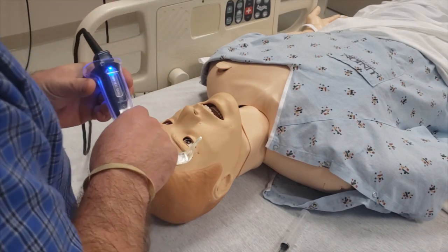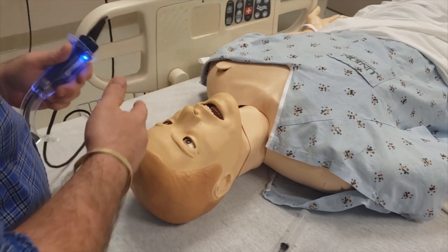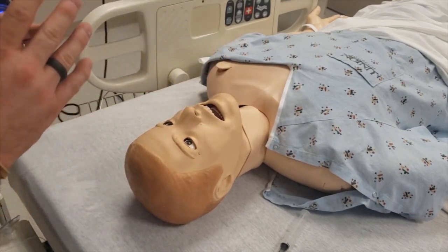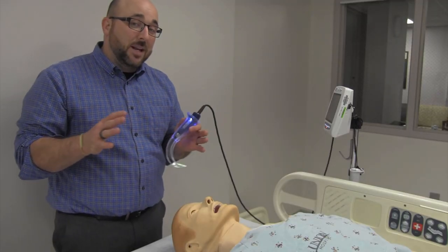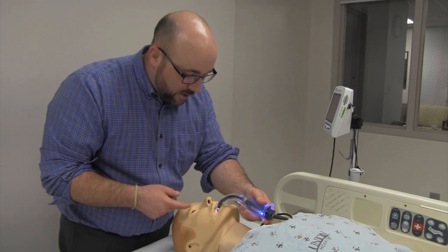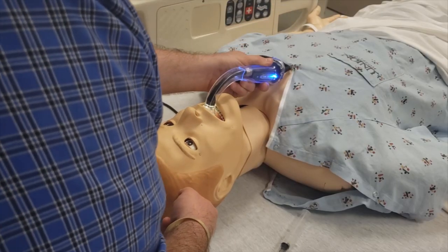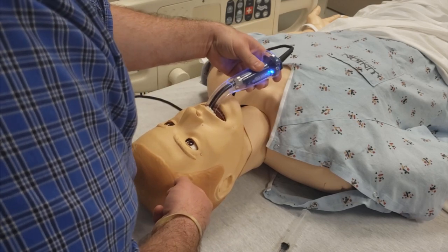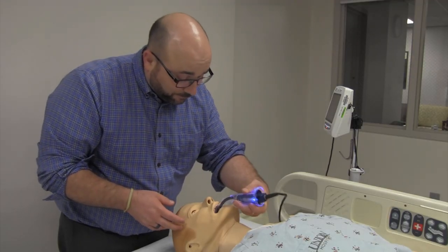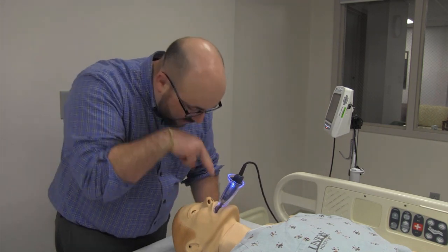Step one: we're going to insert the laryngoscope camera from the left hand straight down midline on the patient. With standard laryngoscopy you'd start on the right side, sweep the tongue, and you're in. But this is different — we go straight down the center. Notice this really stiff, hard angle on here. You can go down close to the chest, or you can start from the side and rotate it into place. Then go in and watch as it goes back around the corner.